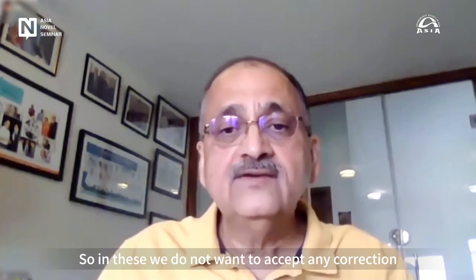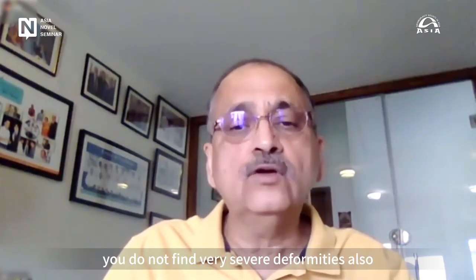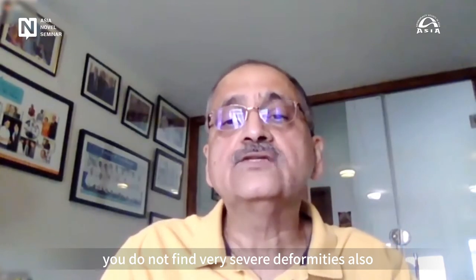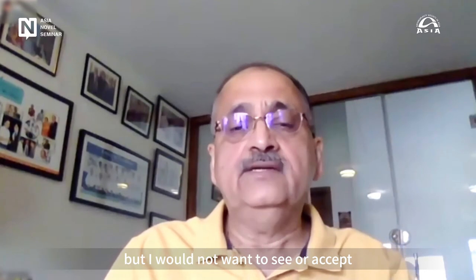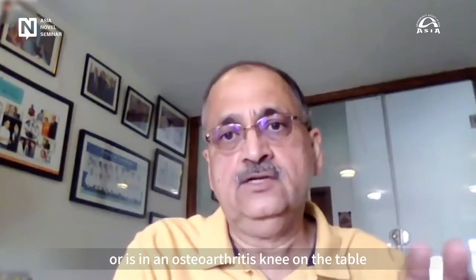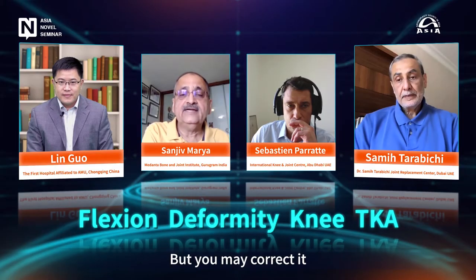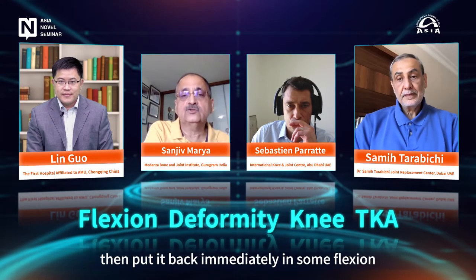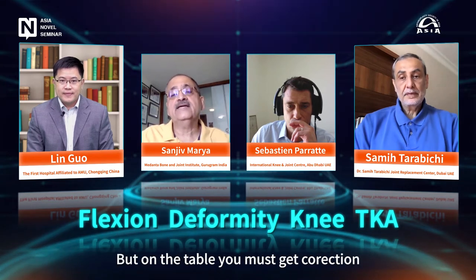So in these, we don't want to accept any correction. And luckily in these, you don't find very severe deformities also. But I would not want to see or accept deformities in an osteoarthritic knee on the table. But you may correct it, then put it back immediately to some flexion and gradually correct later. But on the table, you must get correction in osteoarthritis.